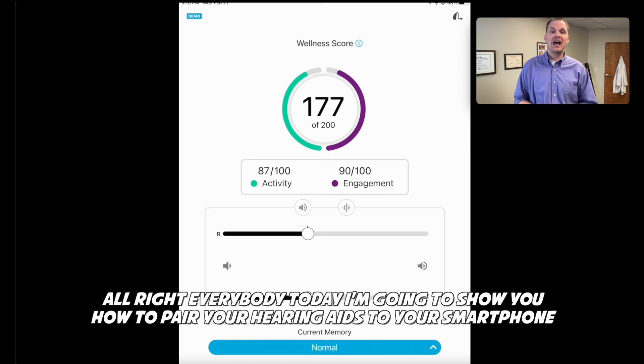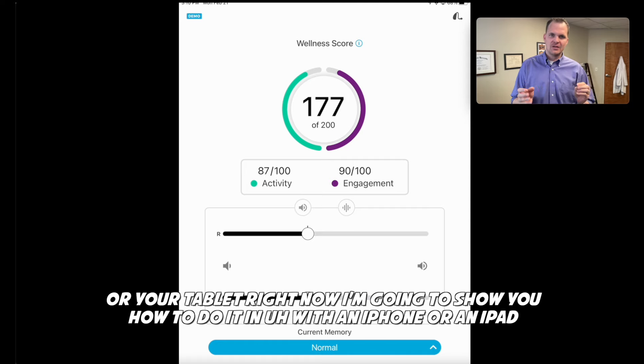All right everybody, today I'm going to show you how to pair your hearing aids to your smartphone or your tablet. Right now I'm going to show you how to do it with an iPhone or an iPad.